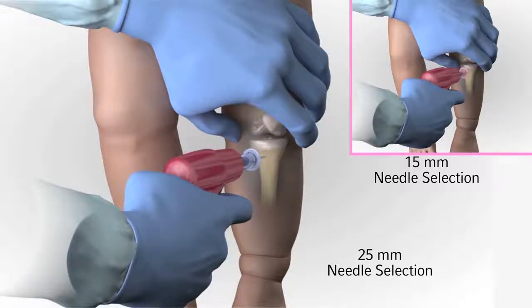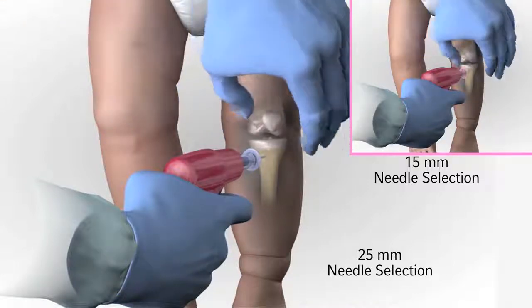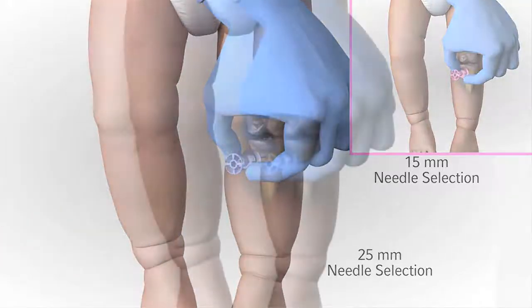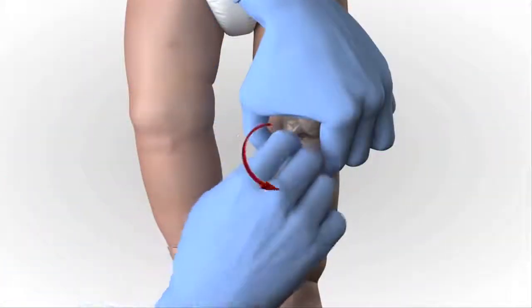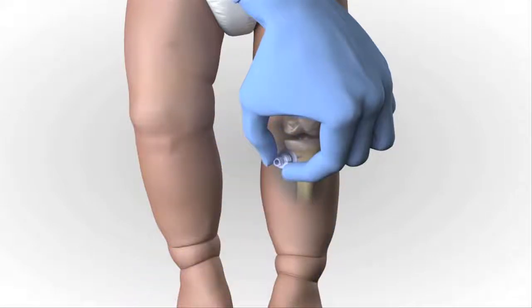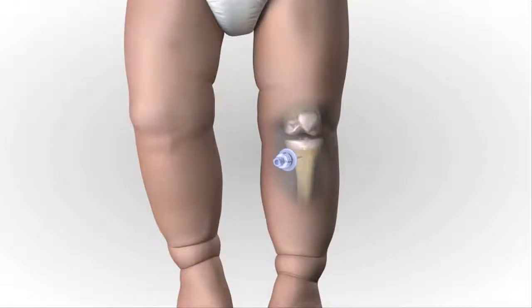Gently drill. Immediately release the trigger when you feel the pop or give as the needle set enters the medullary space. Avoid recoil — do not pull back on the driver when releasing the trigger. Hold the hub in place and pull the driver straight off. Continue to hold the hub while twisting the stylet off the hub with counterclockwise rotations. The catheter should feel firmly seated in the bone.